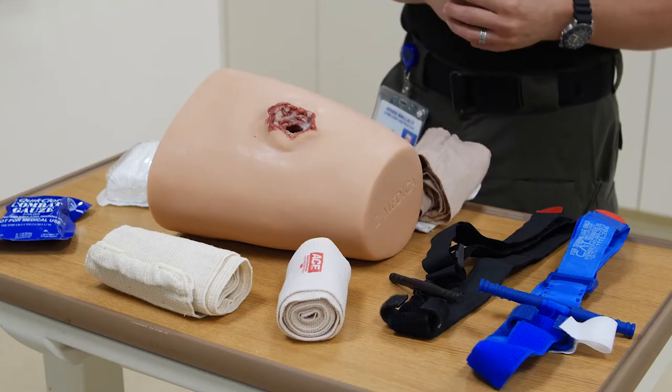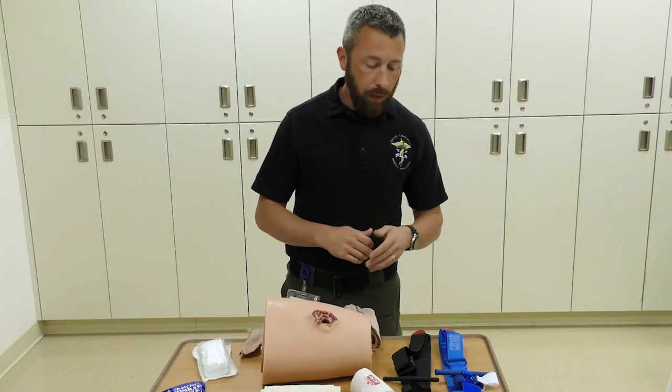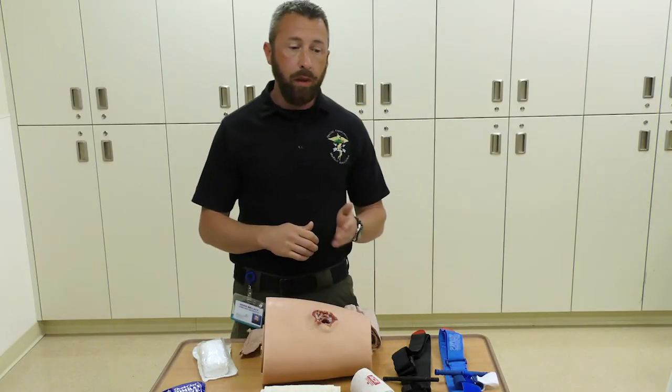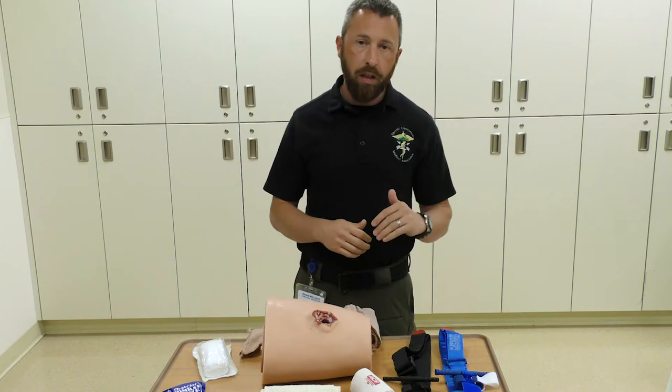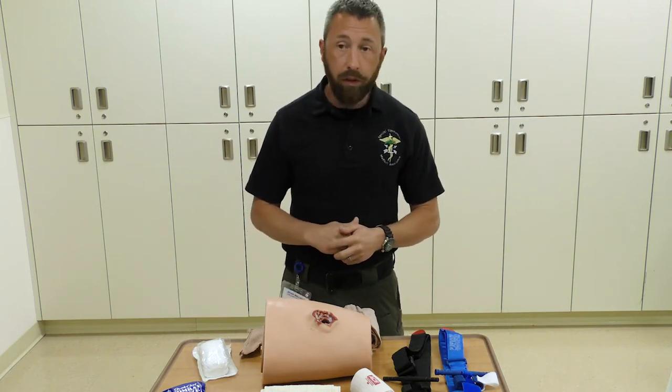The second part will be tourniquet application — what we call self-aid and buddy-aid. We're going to talk about how to place it onto an injured party or onto yourself if you were injured during a critical incident.